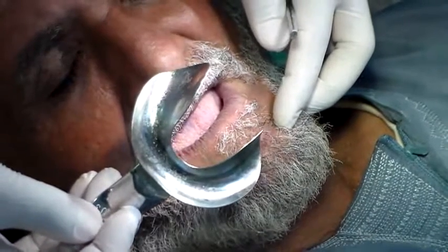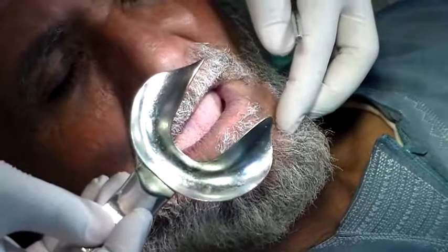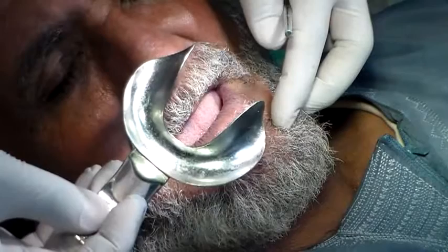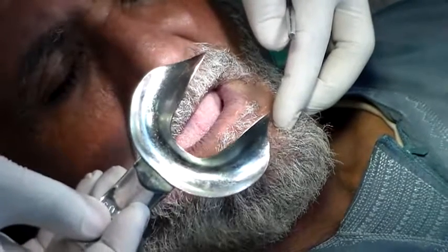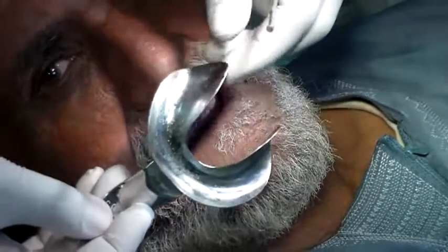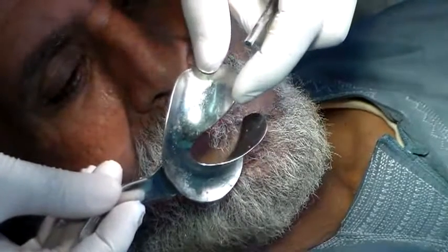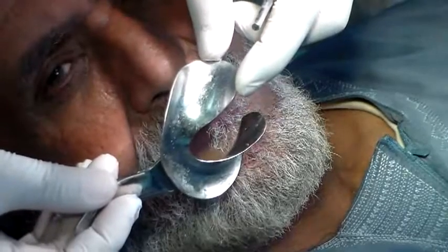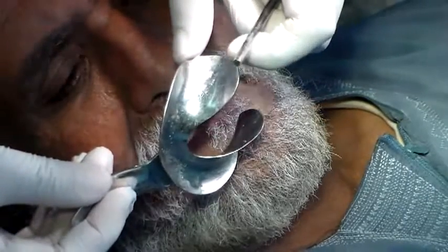You are going to make a selection of the lower tray. I have chosen a non-perforated tray at this time because some of the trays we have here are non-perforated. Ideally you would use an impression compound in this tray. I am just going to show you a modification of how to use alginate in a non-perforated tray using some other techniques as well. You can see that the retromylohyoid region of this tray is quite deep, because the patient has got a Class 1 lateral throat form, so I selected this tray with a deep retromylohyoid area.